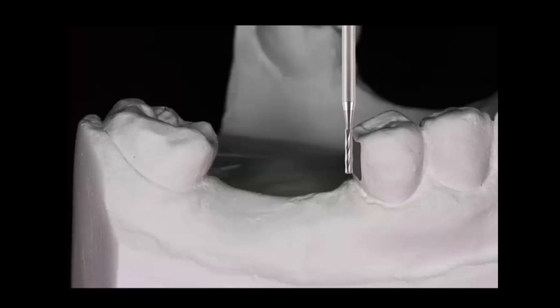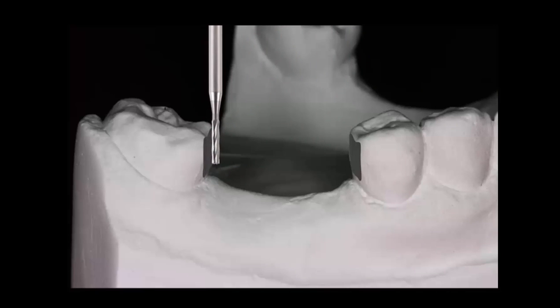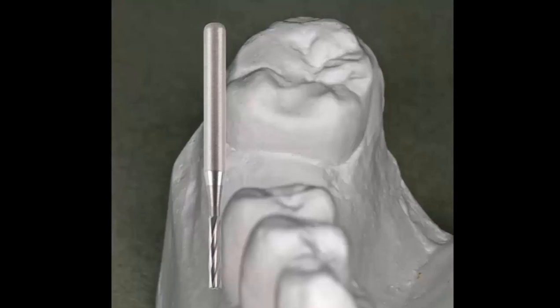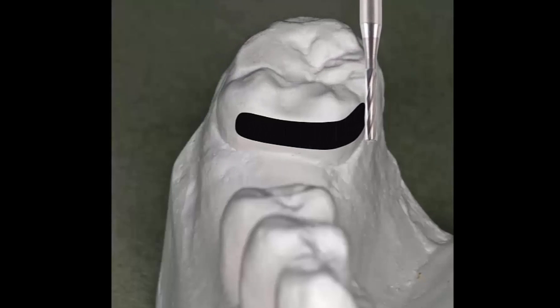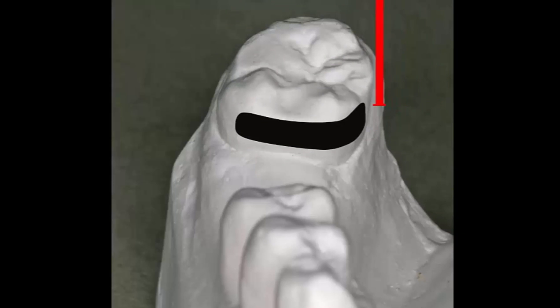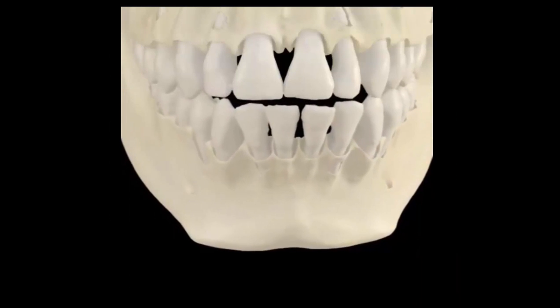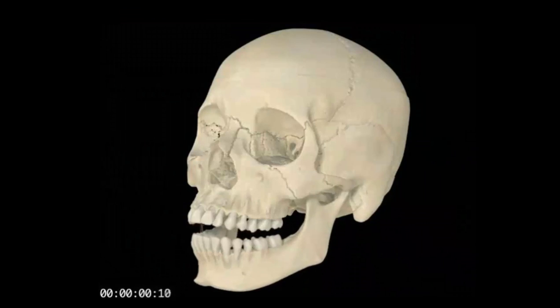A carbide burr is being used to prepare parallel guide planes on this particular cast as a demonstration of how you would like to have those guide planes formed. That same instrument is then used to create guide planes on a molar that's tipped mesially and lingually, creating that guide plane while preserving a distolingual undercut where the clasp can flex into that area and retain the removable partial denture.